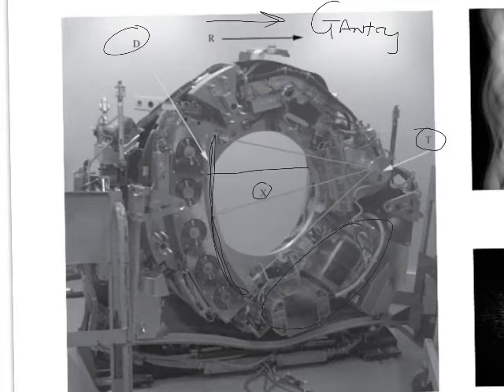I know for therapy, Z-axes can differ, but in the CT world, that is Z. It will always be Z. Thank God. Related to that, of course, we also have a Y-axis that I'll draw through isocenter, and an X-axis. So the Z-axis we're going to have to imagine, but we also have a Y-axis and an X-axis, and they're pretty much where we would expect them to be.